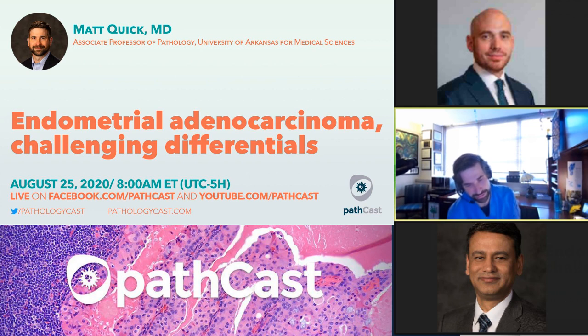I wouldn't use P16. I've seen enough strong P16 staining in high grade cancers, basically anywhere, right? To not have a very high level of trust for that stain. I think there are better options. They don't work every time, and certainly the bad answer here, the easy way out, is to say there are going to be cases where you can't differentiate serous from high grade endometrioid.